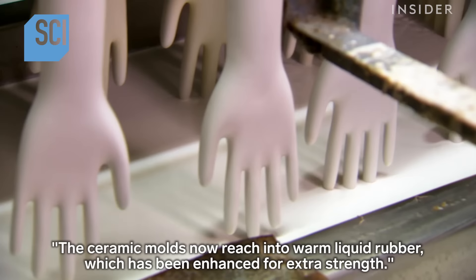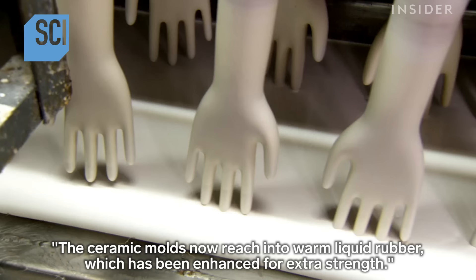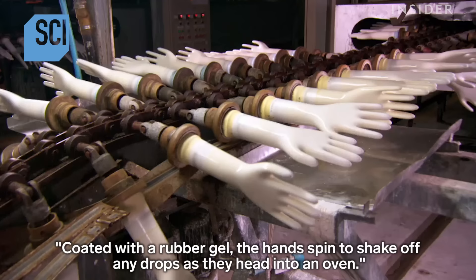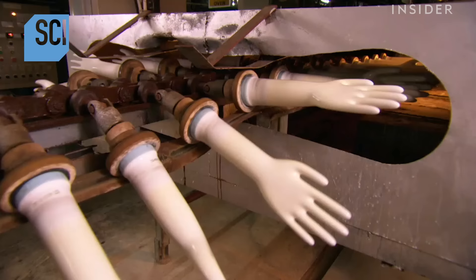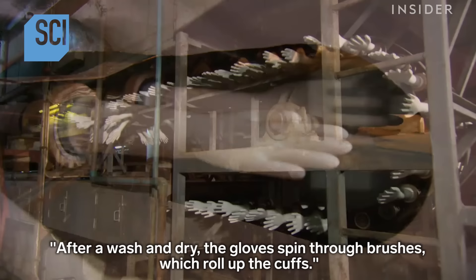The hand molds head into a chemical bath which forms a film on the surface. It's a critical coating because liquid rubber won't adhere to bare ceramic, but it will to this substance. The ceramic molds then reach into warm liquid rubber, which has been enhanced for extra strength. Coated with the rubber gel, the hands spin to shake off any drops as they head into an oven, where under intense heat the rubber dries to the hand form.